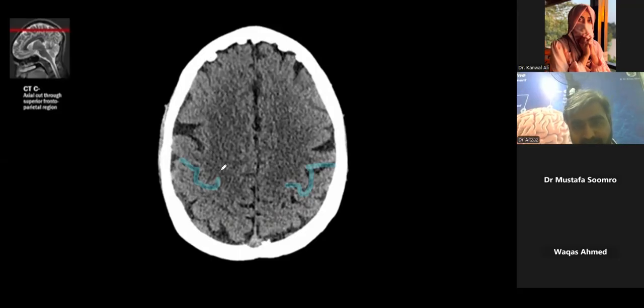Excellent, Dr. Mustafa. This is the pars marginalis. Excellent. So when we say the cortical cut, this is the landmark that we should know. If there is a lesion here, then we will correlate where the lesion actually is. So excellent, this is the cortical one.